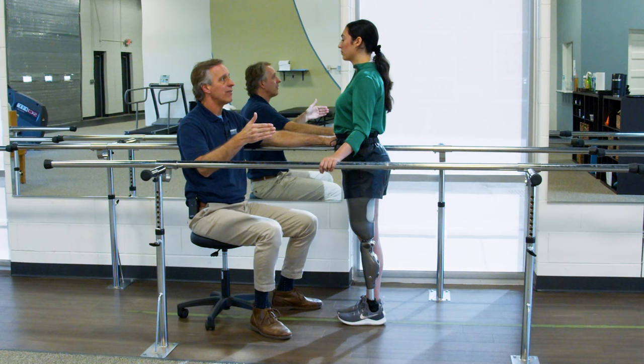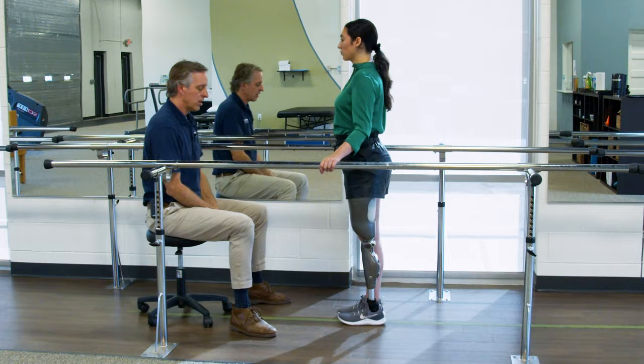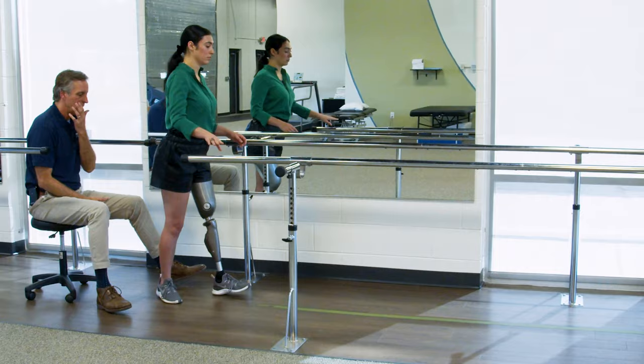Okay, so all I've got to do is keep the same cadence of walking with a longer stride, and I go faster. So all I want from you, Tracy, is not too big a step to start with, and we're just going to go back and forth a couple of times. But take a longer step out towards me. There you go. Good. And then turn around. Same thing going back, just a nice long stride.